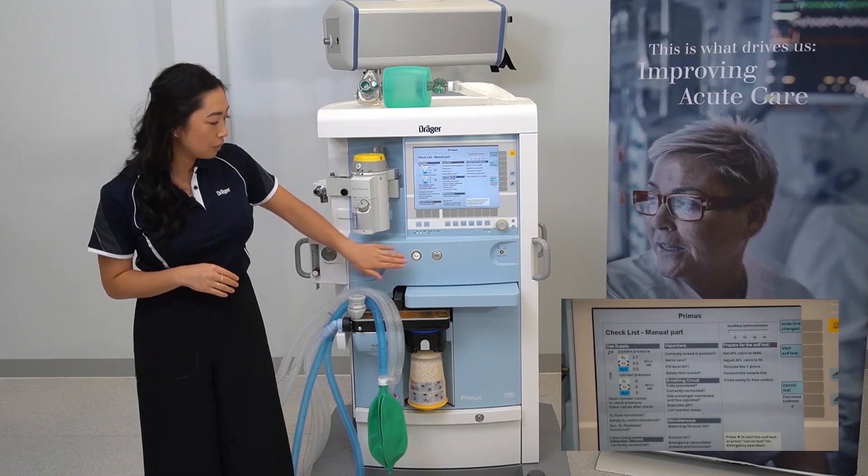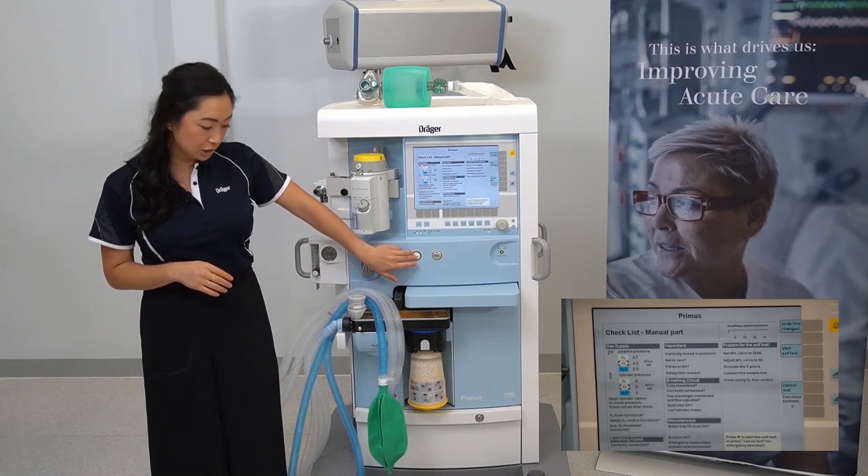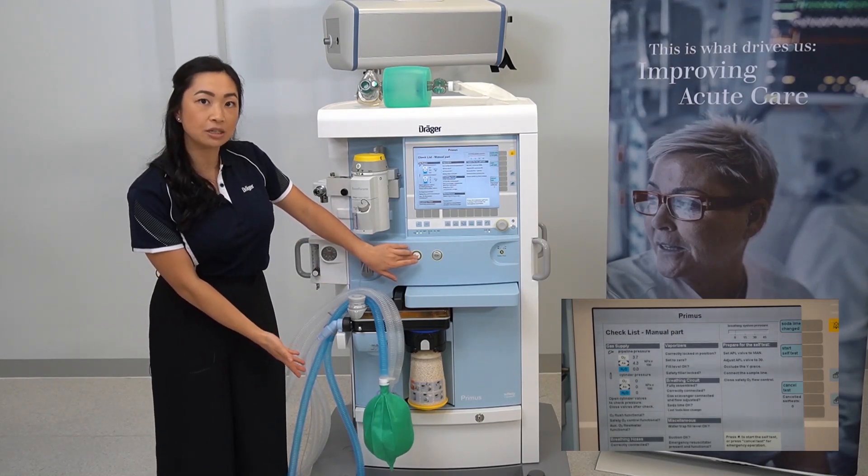Just keep in mind to close the valves on the reserve gas cylinders to prevent inadvertent depletion during therapy. To check your oxygen flush is functional, hold down the oxygen flush and watch for the expansion of the breathing bag.